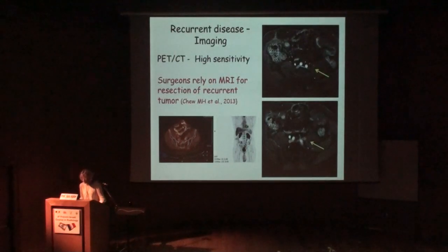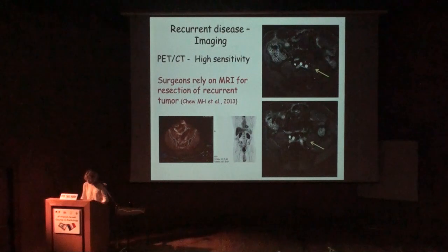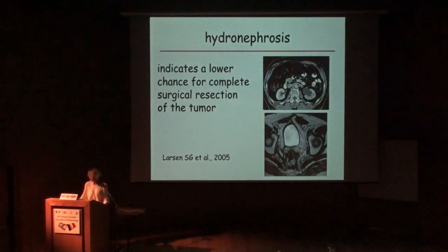And here is just his PET. He has a PET CT also, because PET is very useful in the follow-up and detection of recurrent disease. On the PET we saw, and we saw it also on the MRI, he had a mass in his lower abdominal wall, and he had the hydronephrosis. The hydronephrosis is from the PET CT, I took just the CT to show you. We don't do CT, PET, and MRI. We do the PET and MRI locally, especially for the surgeon. So this is from the PET CT, and the hydronephrosis, a new hydronephrosis.